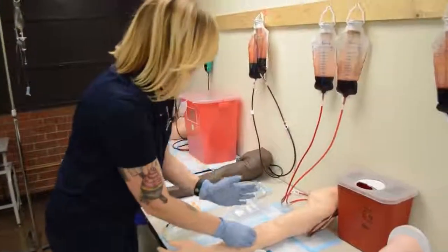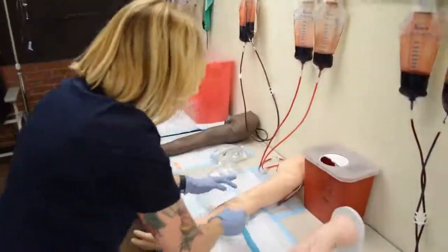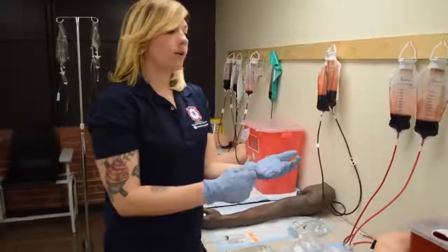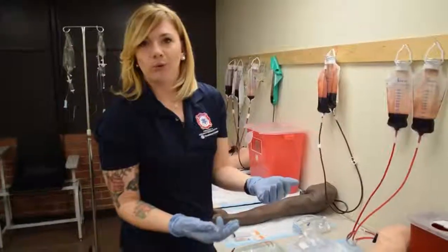If your patient is facing straight on, you should be facing straight on. If they're at an angle like this, you should be at an angle. You always want to be moving with your patient, not reaching over your patient, reaching over your hand. That not only will overextend you, but can cause pain to your patient or can set yourself up for accidental sticks, which you don't want.